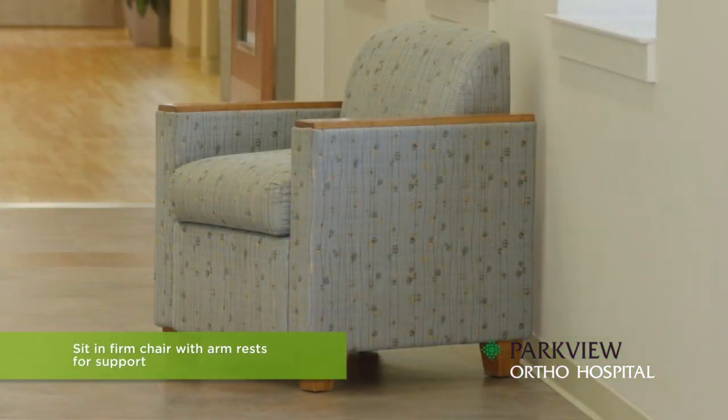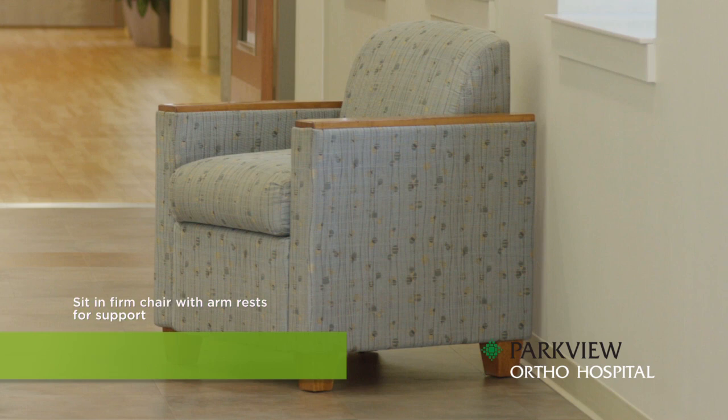You will want to sit in a firm chair that has armrests for support. Avoid using low-sitting soft chairs or couches during recovery.